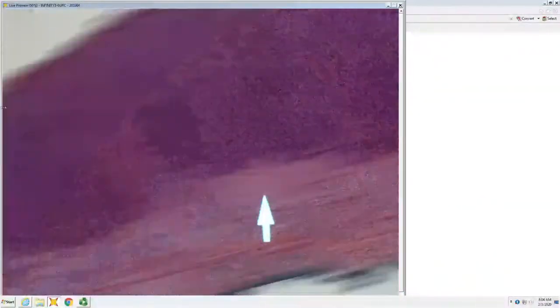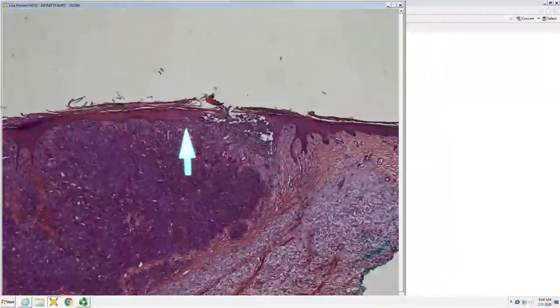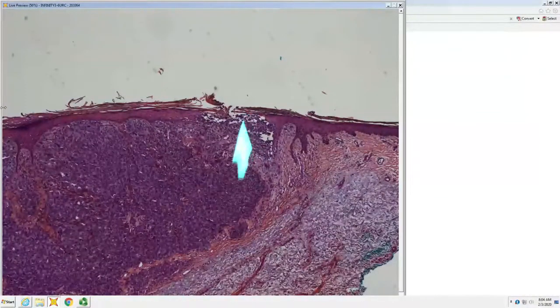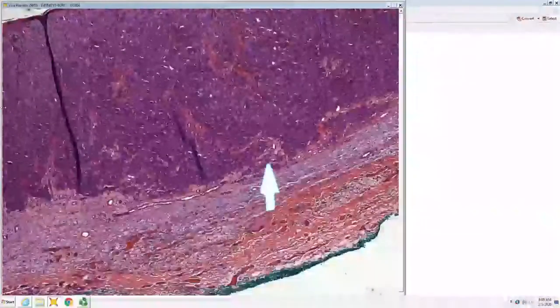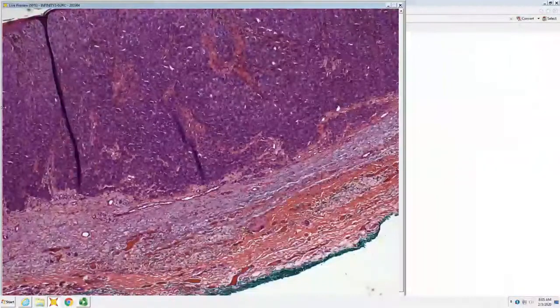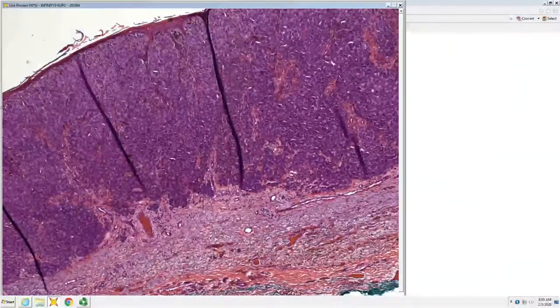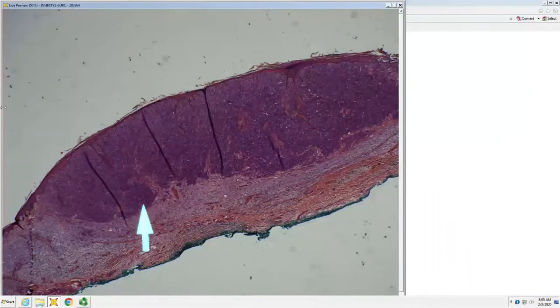So it is melanoma, fairly symmetrical side to side, except when you look at the epidermis, there's so-called consumption of the epidermis here. It's all the way, nests sitting all the way up against the corneum. At the base, you have a parallel theque pattern, where you have parallel rows, like a trabecular pattern of tumor at the base. That's very common for melanoma. For nevoid melanoma, that may appear symmetrical at scan. In this case, there's really no maturation and no dispersion at the base. And the other bit of history is that this is actually metastasis, and this is epidermotropic metastasis.